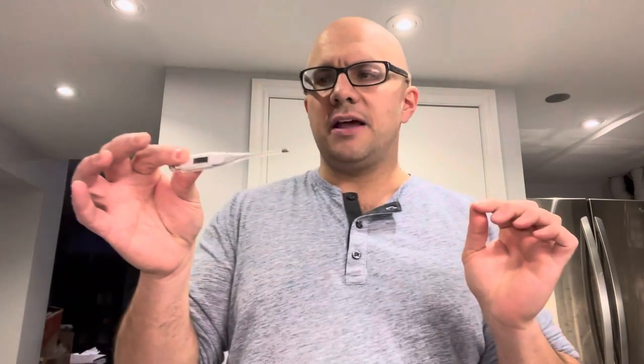What you want to do is start off by removing the protective cover, because you're most likely going to have a protective cap. Make sure you're using the part that has the metal contact point, because that's what's going to measure your temperature. If you have the cover on, it might not get a reading, so take it off and expose that metal piece.